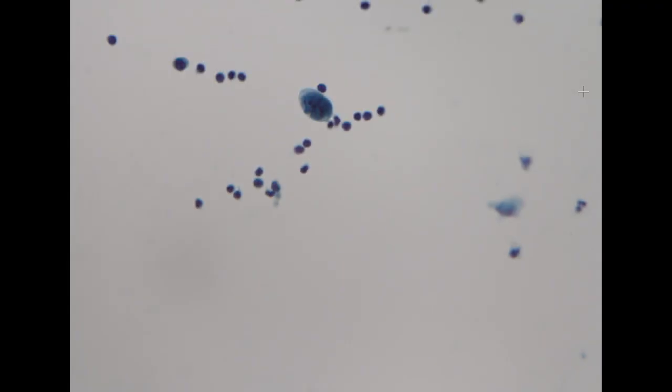So the next specimen, also coming from a patient with a known past history of lung adenocarcinoma who has received targeted therapy. This is the cytospin preparation. Basically, we only see inflammatory cells and very, very scattered atypical cell clusters.